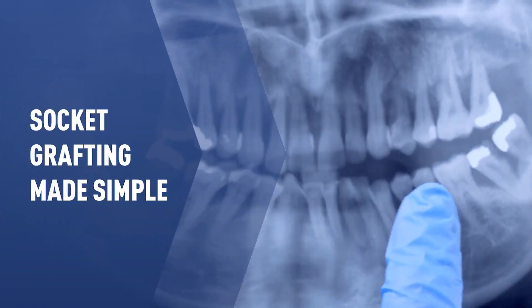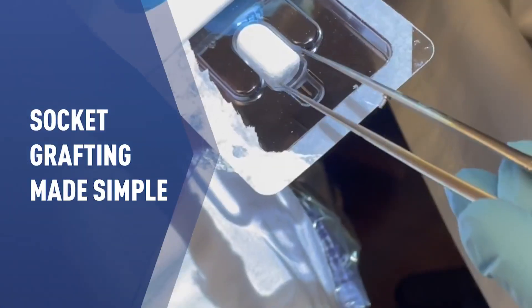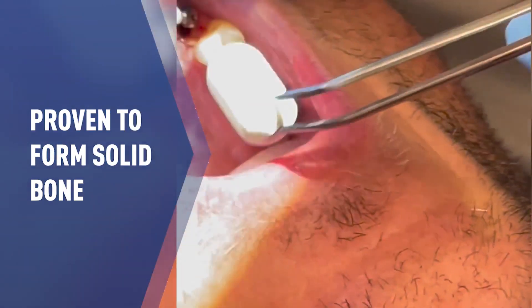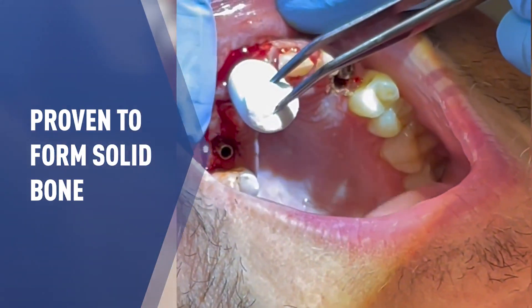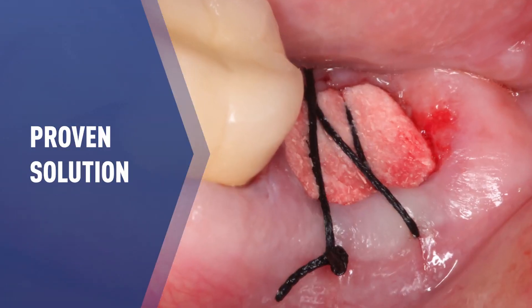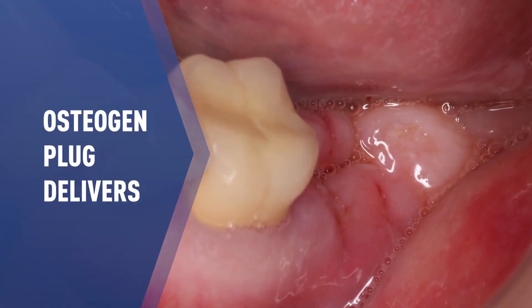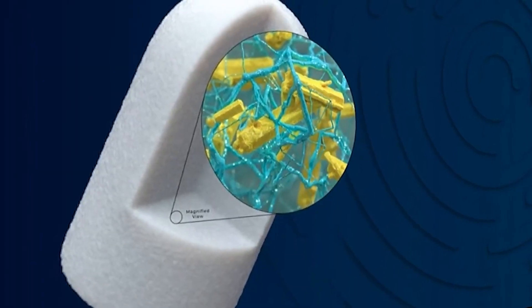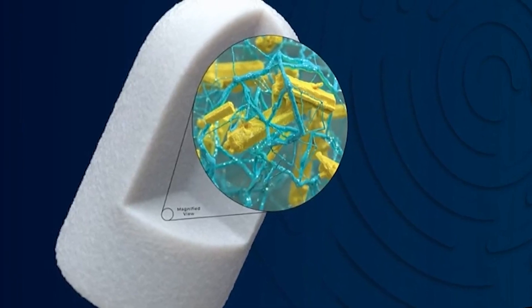When it comes to socket grafting, first and foremost we all need a product that works to form solid bone. None of us have the time to hope and pray it works, especially when waiting to deliver an implant — time is of the essence and we need a proven solution. Osteogen Plug delivers.